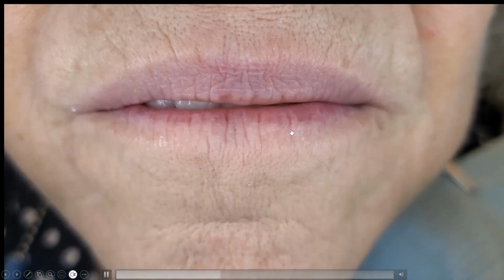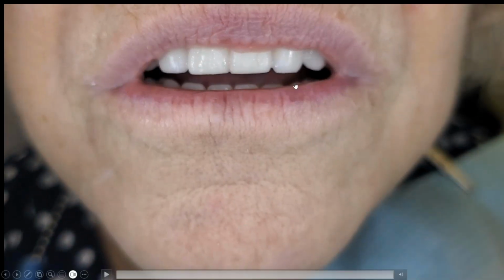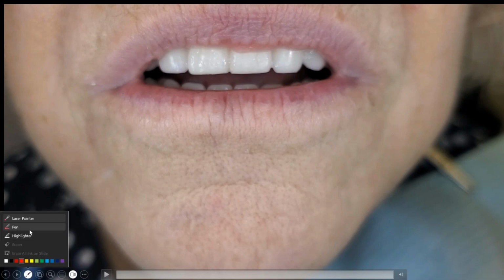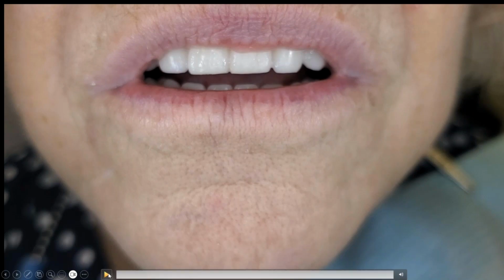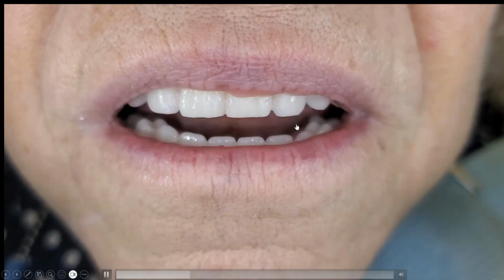See the spacing? So when she talks, her lower left lateral actually moves ahead of the upper left lateral. It's brilliant. So when you can identify that, then you can set the teeth to accommodate that. It's not going to break.